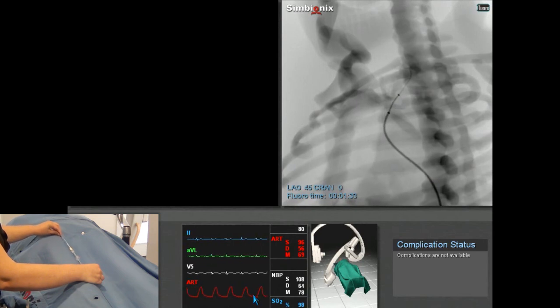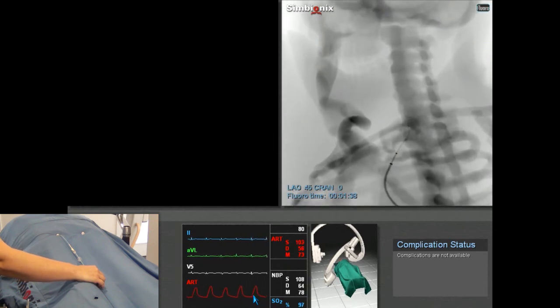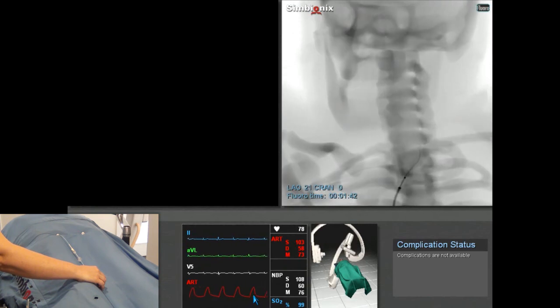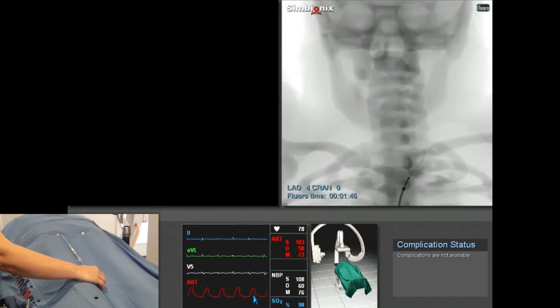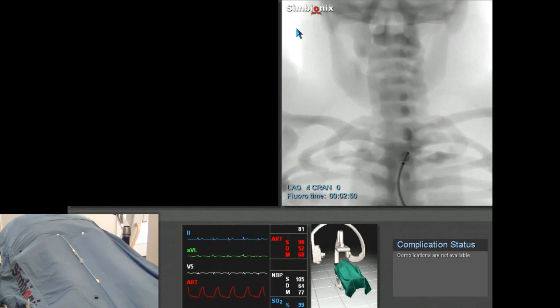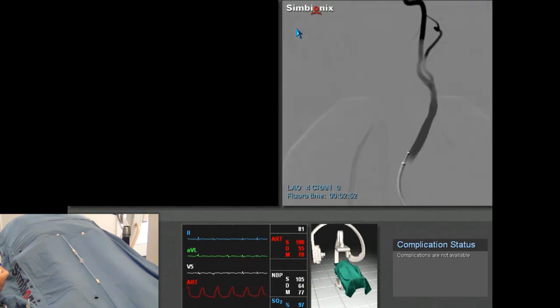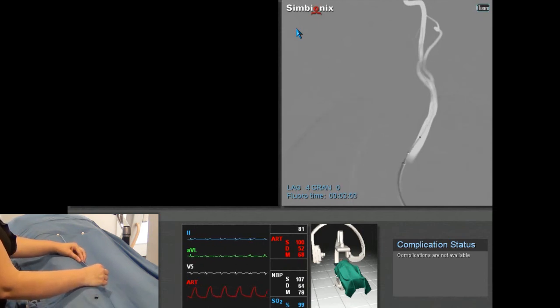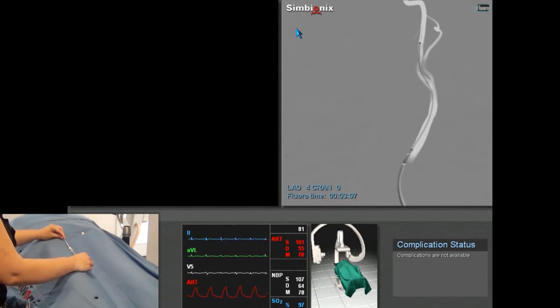And the guide catheter is advanced up over that. Initial injection of contrast and then roadmap so that one can direct the wire and then the catheter into the internal carotid artery. So advancing the 5 French vertebral catheter and then over that the guide catheter.